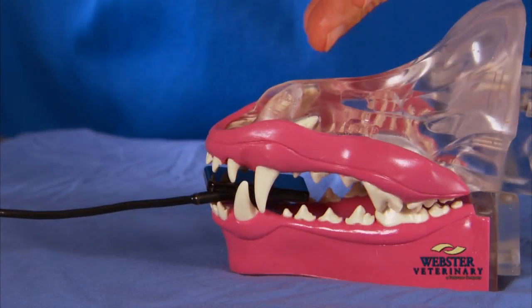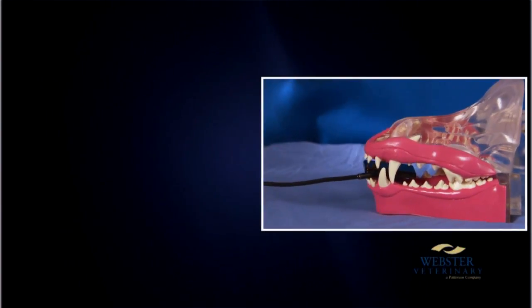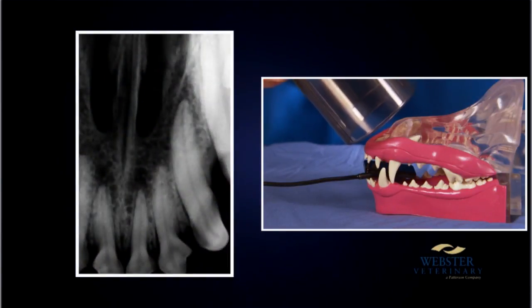Using this model with artificial gums, and if you can imagine lips, is a good time for us to discuss the two most common positioning errors we find in veterinary dentistry. If we use the cone to achieve bisecting angle technique, the image of the incisors will be appropriate.